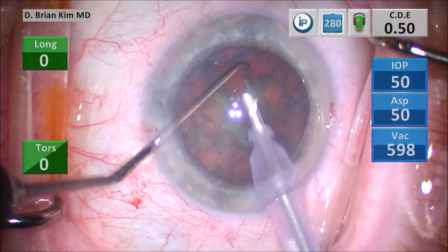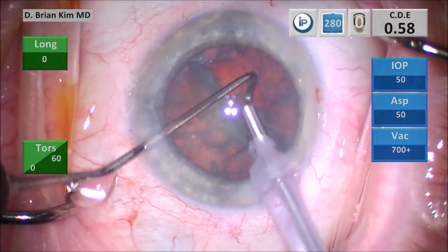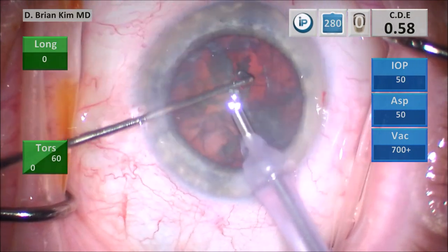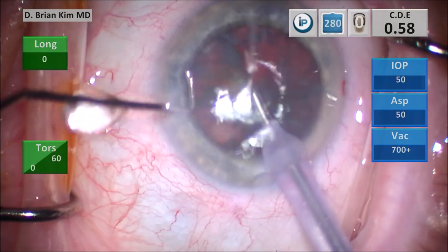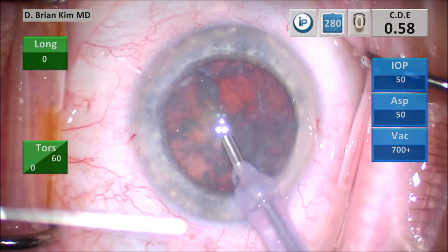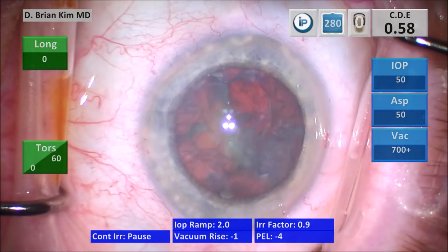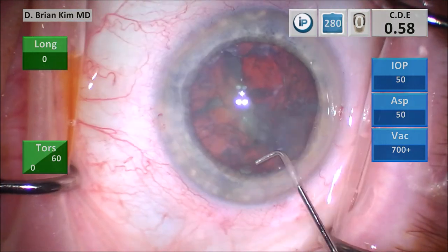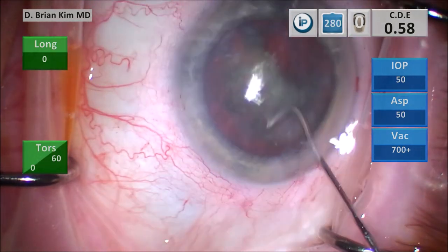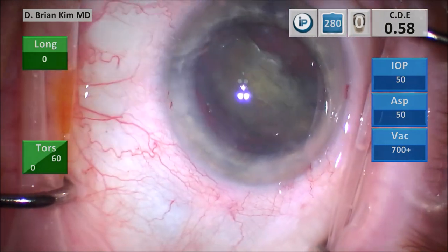I'm crushing the lens with the chopper against the phaco tip, using high vacuum and a little bit of ultrasonic energy. You can see here I'm trying to rotate the second hemi-nucleus — it is not really moving very well. Rather than trying to use brute force and traumatize the zonules, I'm going to come out with the chopper, put some viscoelastic into the eye, pull out the phaco tip, and use my right-angled hydrodissection cannula. I'm going to go up underneath the anterior capsulorhexis edge and gently start to re-hydrodissect the lens. You can see the lens is actually prolapsing centrally as I do this re-hydrodissection technique.